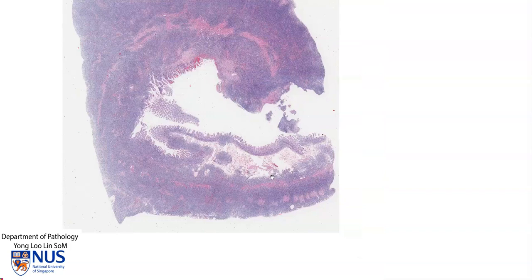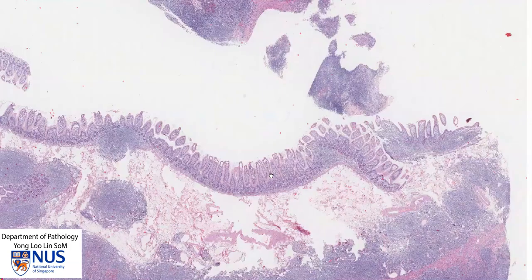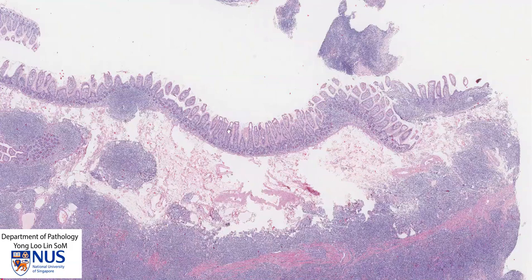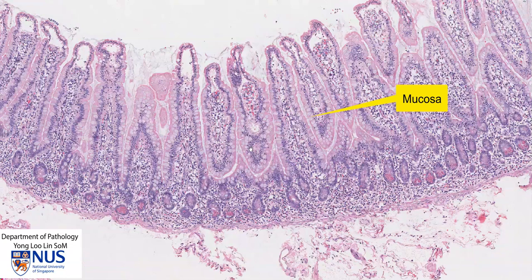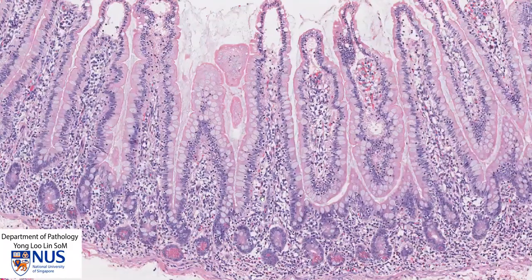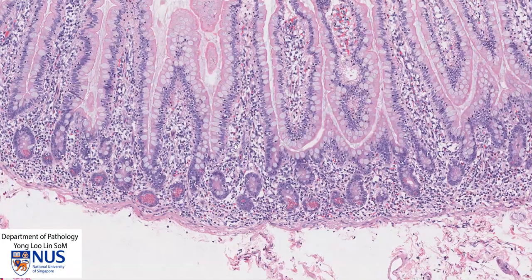Let's first take a look at some recognisable normal structures. Here we have the small bowel mucosa. We can recognise the finger-like villi, and these villi are lined by tall columnar cells with some interspersed goblet cells. Normally, we do see some lymphocytes and plasma cells in the lamina propria, so this is normal and is not part of the lymphoma.